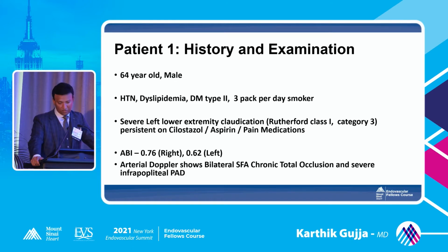Arterial Doppler, as we discussed this morning, ABI first, arterial Doppler next to categorize your lesion. SFA chronic total occlusion.